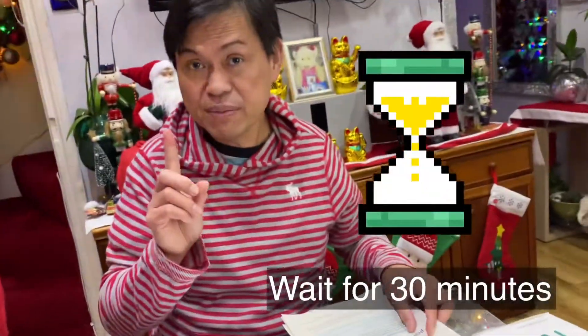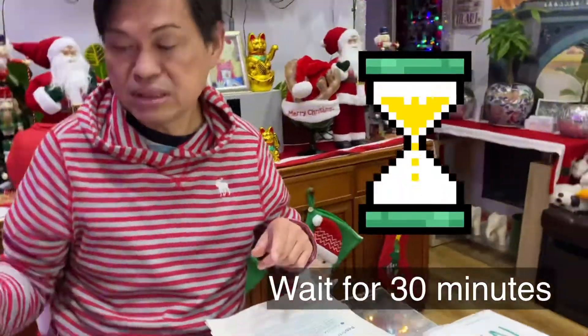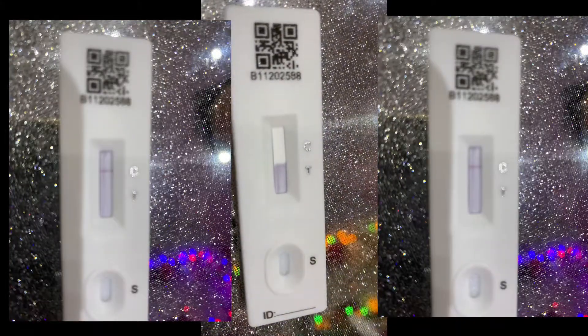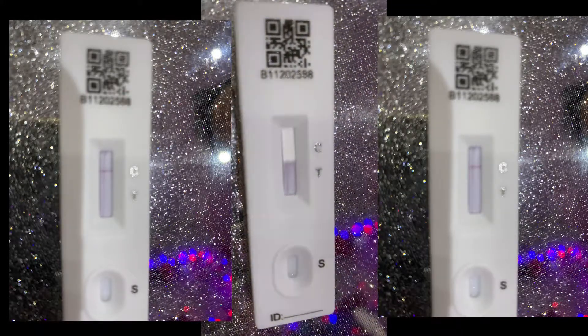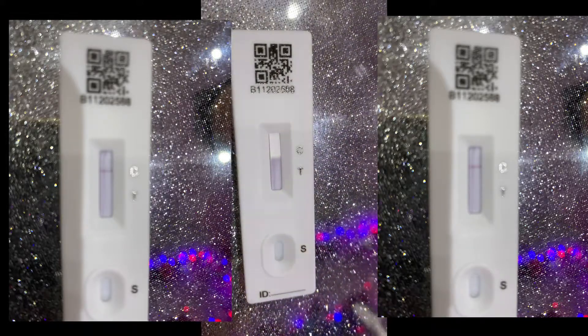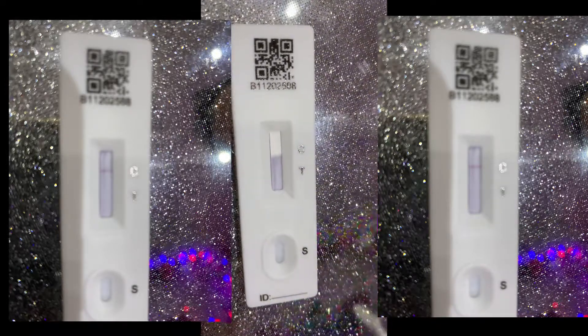Now we'll wait for 30 minutes. I have to set the timer. It's going now — it's testing. We wait for 30 minutes. You can see it's moving.